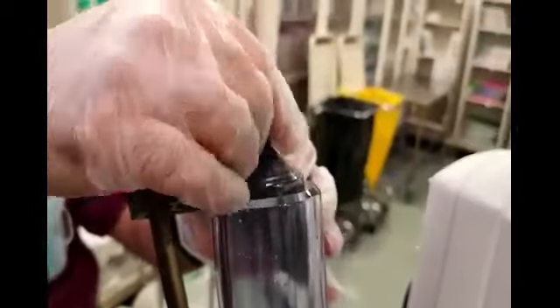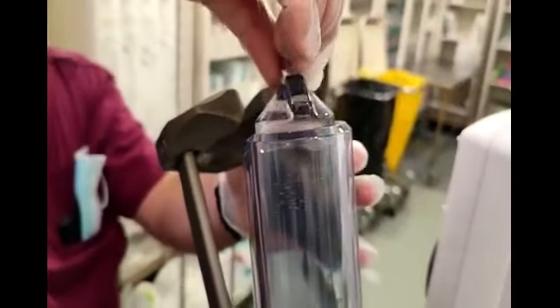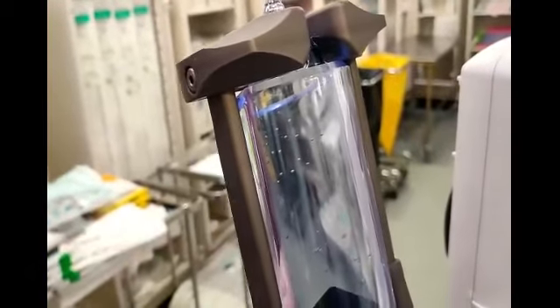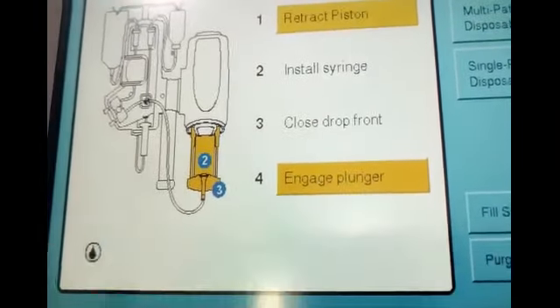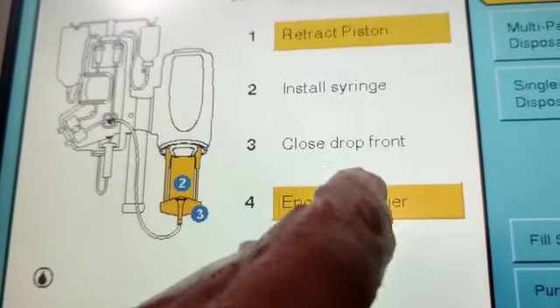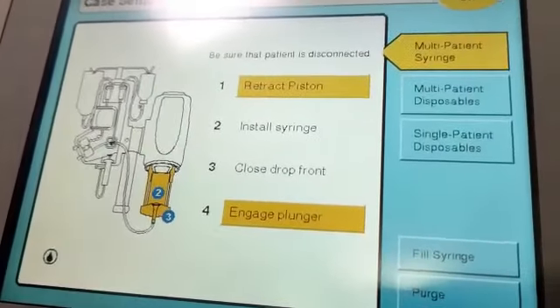After retracting the piston, make sure the syringe knob line is fully parallel — otherwise it will not lock. Keep it in the parallel position and then rotate it in. There should be a click sound; a click sound means it is now properly adjusted. Once the syringe is installed, the third step is 'Close drop front' and then 'Engage the plunger.' I'm not going to engage the plunger because this is a reuse syringe already filled with contrast — engaging it would splash all the contrast out.